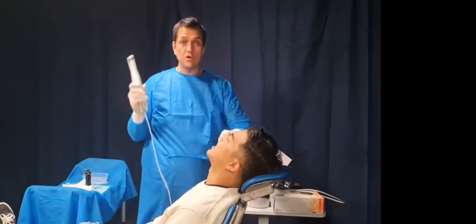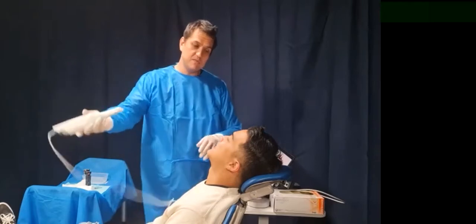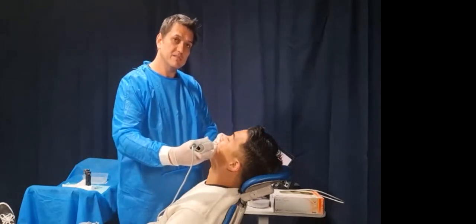out of the mouth. Now, do not turn the scanner off. Do not turn it off. We want to run that back around this way and place it back in and keep going. Does that all make sense? All right, well, I hope that made sense for you.